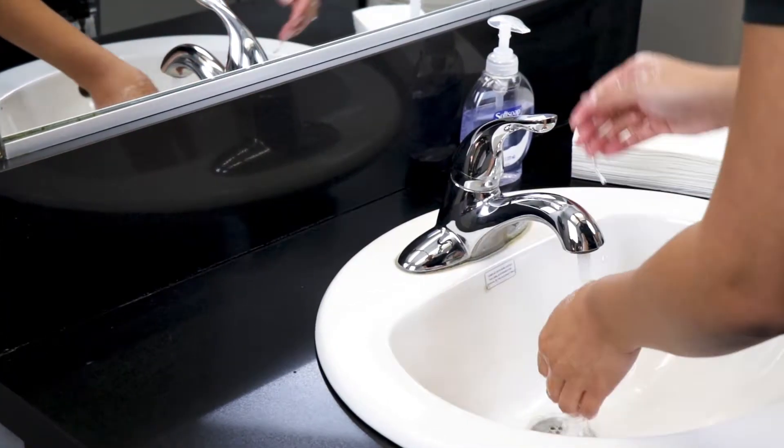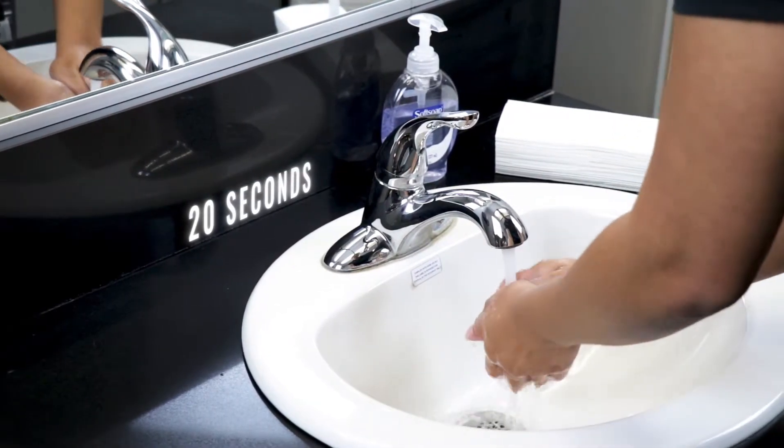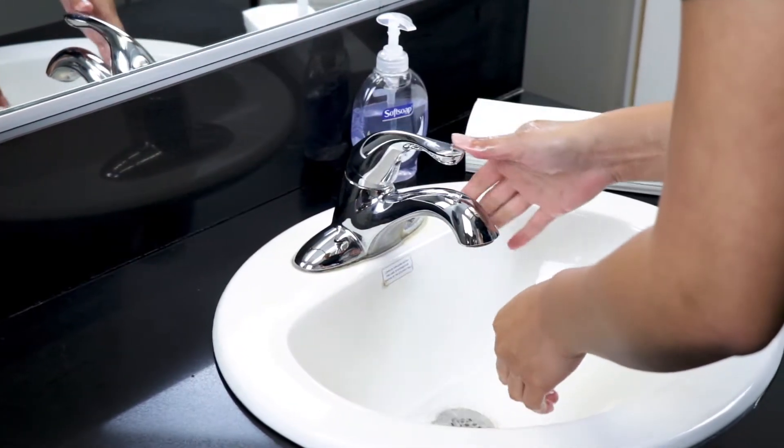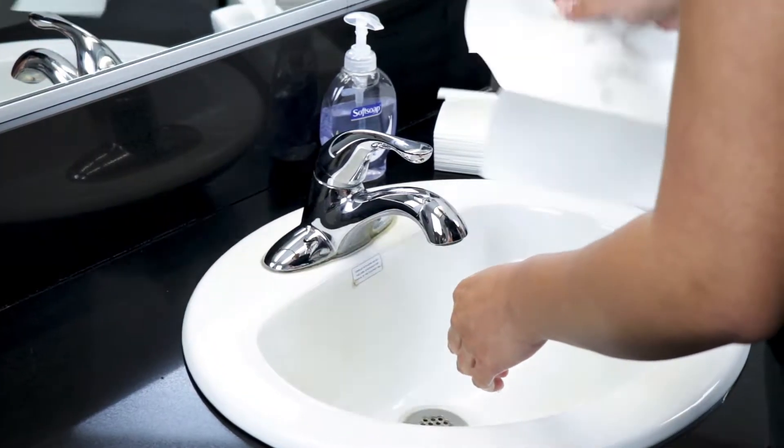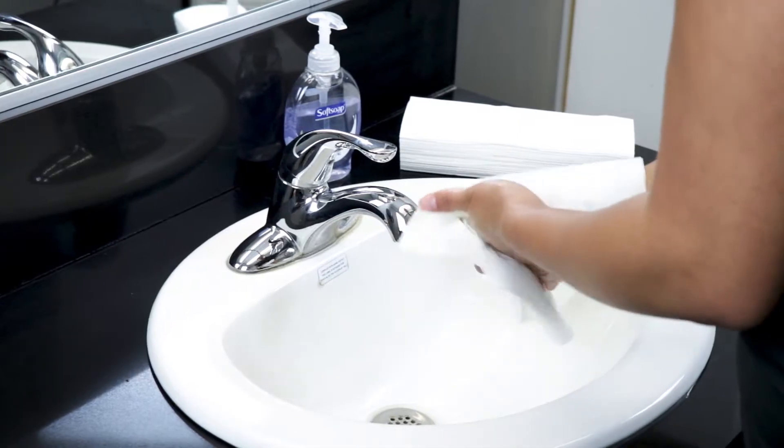Be sure to wash the area where the blood sample will be taken with warm water and soap to reduce any chance of infection. Then dry your hands completely before testing. Have your meter, blood glucose test strips, lancets, and lancing device ready to begin.